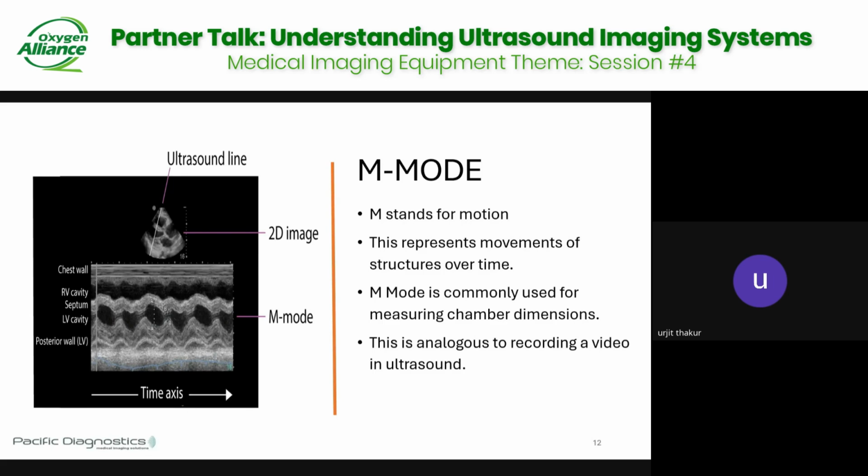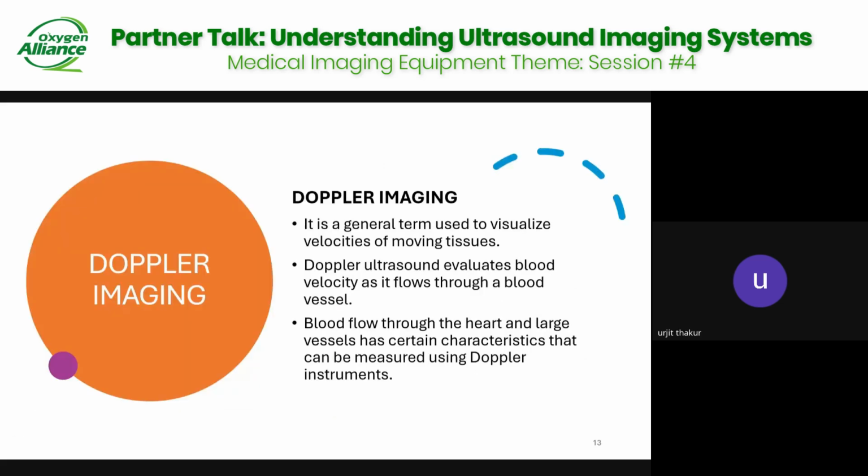So that is what we use the M mode for, mostly in the cardiac applications is where it is used. Then we come to Doppler imaging.